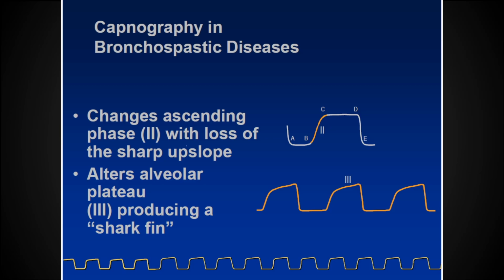Why is it able to? It's just the different weights of the molecule. Ooh, I do not know, my son. All I know essentially is that CO2 diffuses, I can't remember now, like 20 times easier than oxygen. It comes down to a level of chemistry that I definitely don't know. Okay. Good. So the shark fin is kind of just like wheezing in general.